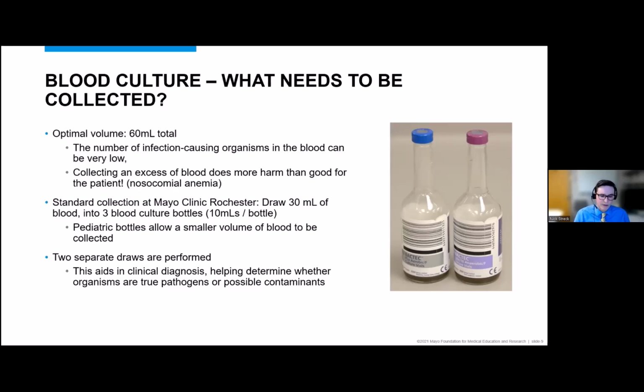I do want to note there is a slight misconception about the pediatric bottles. They're designed for our pediatric patients to receive those smaller volumes, but there's a misconception that they're actually designed for higher sensitivity and ability to detect organisms better. That's really not the case. There have been comparison studies where the same patient has had pediatric and adult blood culture bottles drawn, and it doesn't actually increase the sensitivity.